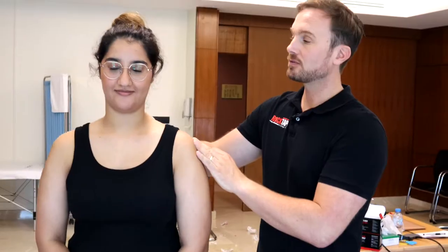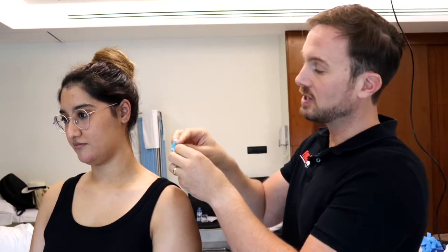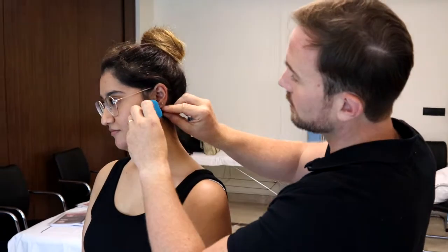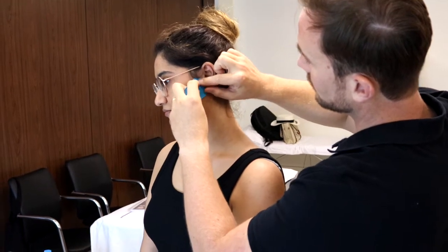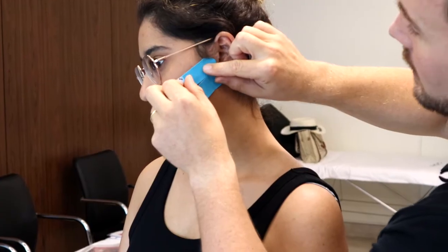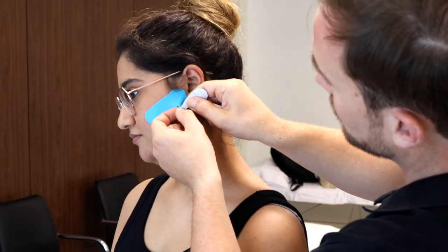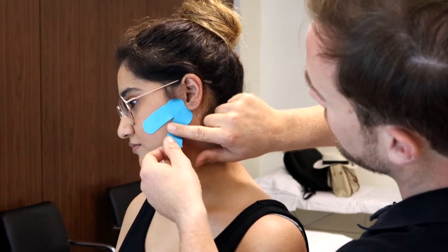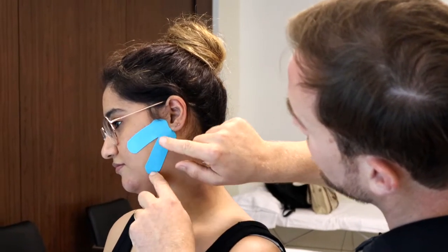Number one: the first technique, and I'll put the references below the video for the research that looked at this, simply uses a small piece of tape which goes directly over the TMJ region. You've got to cut the tape in order to fit just in front of the ear there without pulling on too many hairs. Apply that with a light stretch down over the cheek — I've split the tape here so it's a little bit more comfortable and we can customize it by bringing it lower down over the mandible region. Secure that tape in place. I've seen a couple of research studies looking at this application and reporting that it was helpful for the study group of patients.